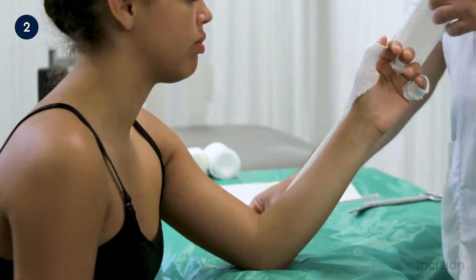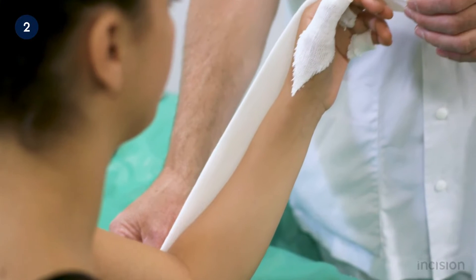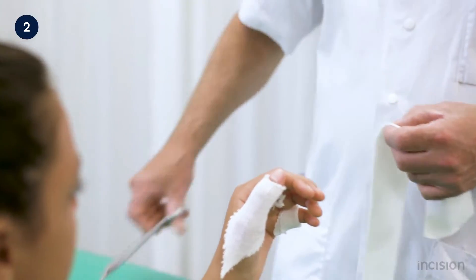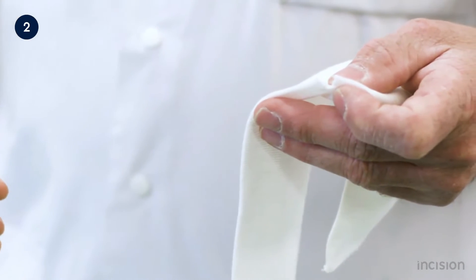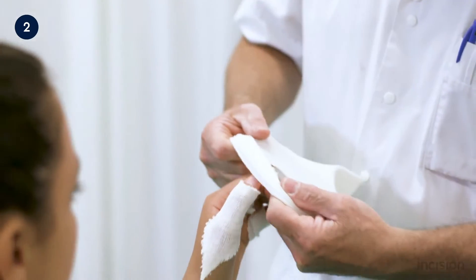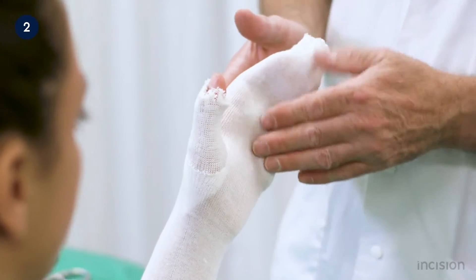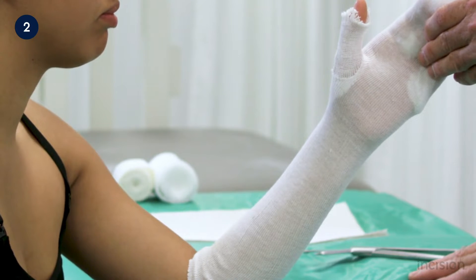The length of the stockinette to be applied over the forearm is now measured. It should be long enough to cover the entire forearm and include the entire hand. The orthopedic cast technician decides where the hole for the thumb should be made and a small cut is made at that point. The stockinette is then rolled up and gently passed over the entire hand and forearm. Any wrinkles in the stockinette are smoothed out, as wrinkles may cause skin irritation.